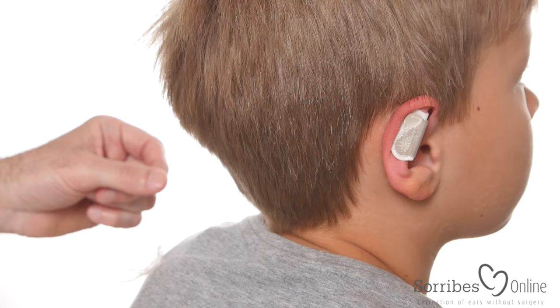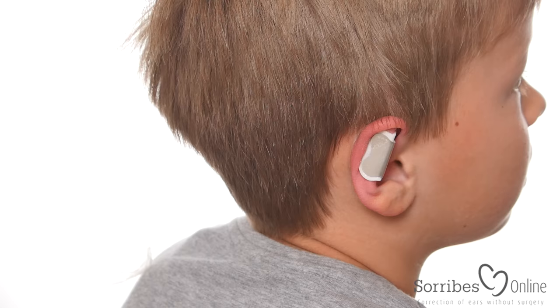You should wear it for minimum 12 to 18 hours a day. Does it hurt? No. Good.